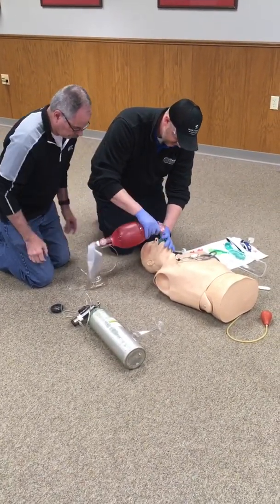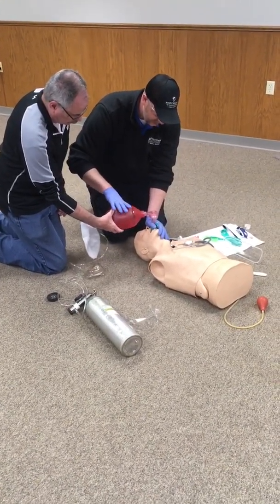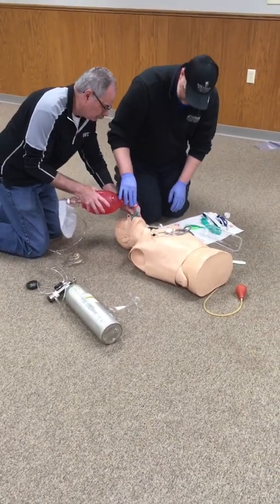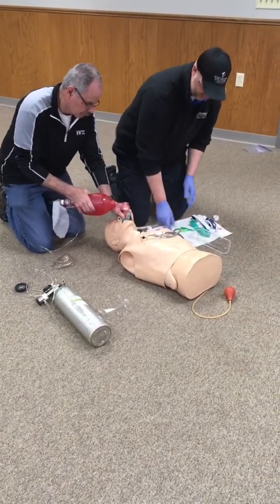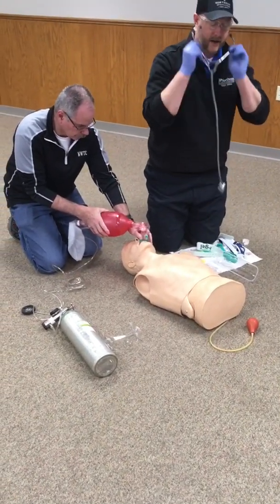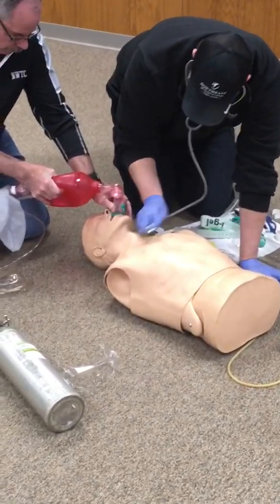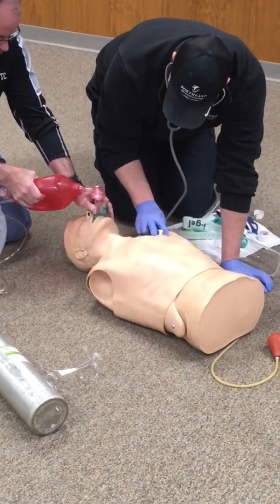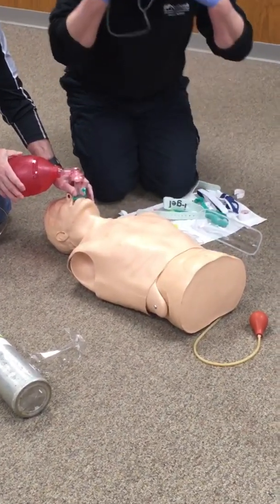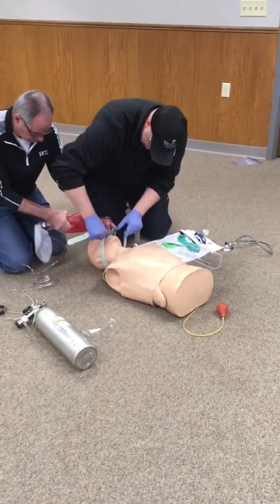I'm going to take the BVM and, while holding the IGEL in place, give a breath to make sure that we have chest rise. I'm going to have my partner continue to ventilate the patient while I listen to lung sounds and make sure that we have a good seal. I'll have them give a breath and listen to epigastric. Lung sounds are present, no epigastric sounds, so we're going to go ahead and secure our IGEL in place.